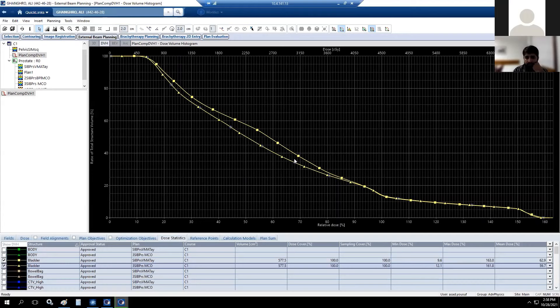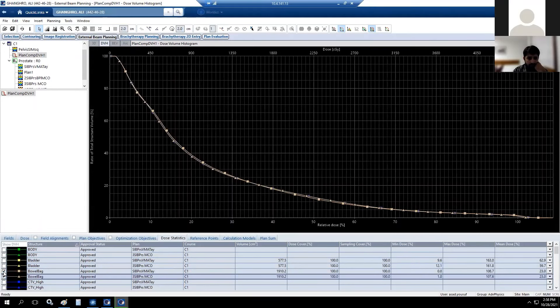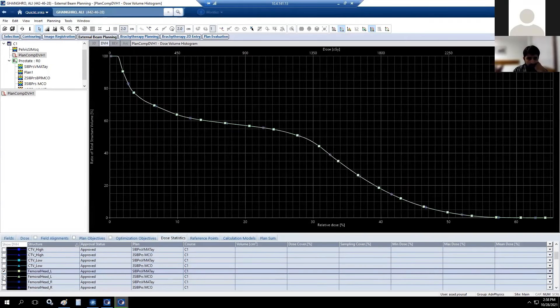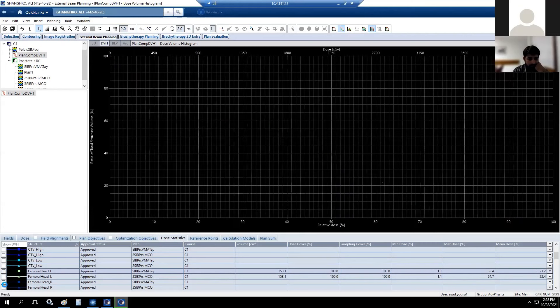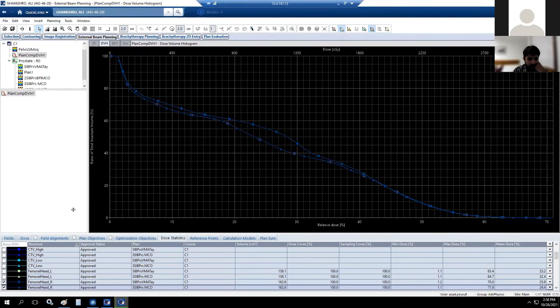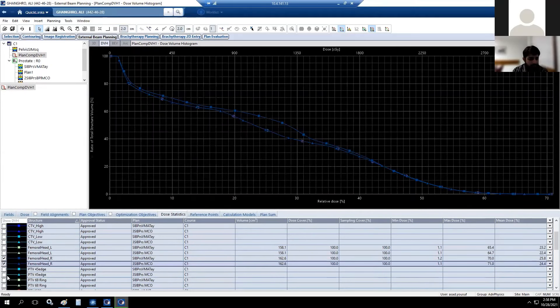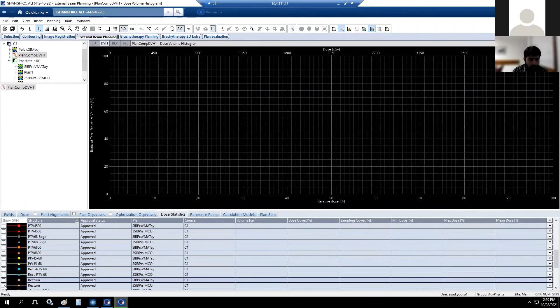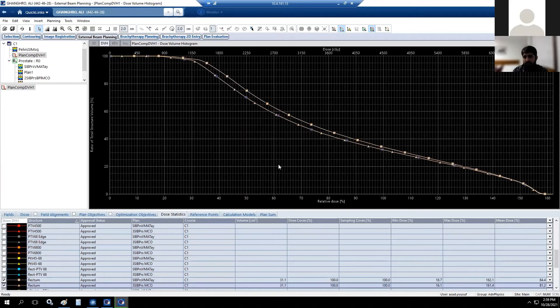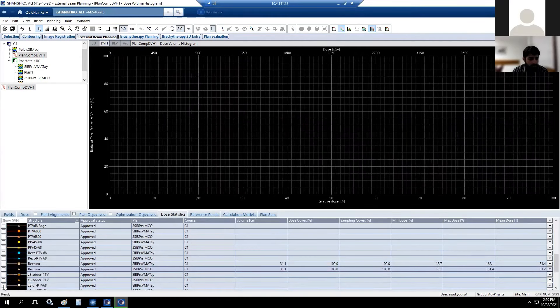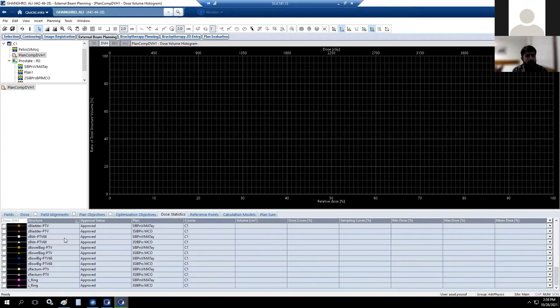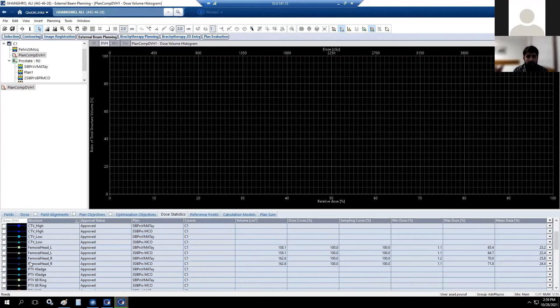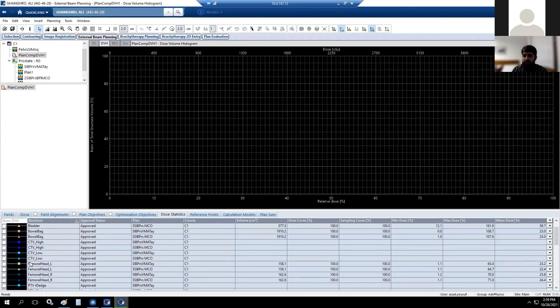Comparing the plans: the bladder improved a bit on the lower dose side. The bowel bed is the same. The femoral head is improved, and the right femoral is also improved in the lower dose region. The PTV coverage is the same. The rectum is also improved but with very little difference. This demonstrates that whatever plans you are satisfied with, you can further test with MCO to verify and potentially improve plan quality.